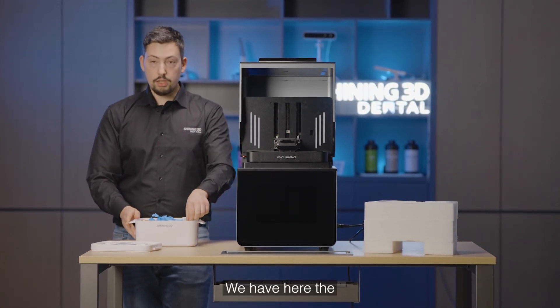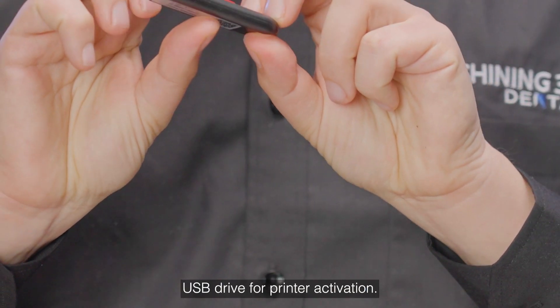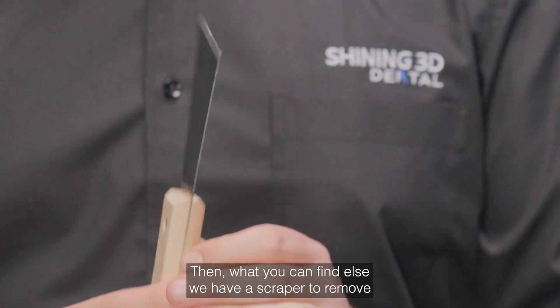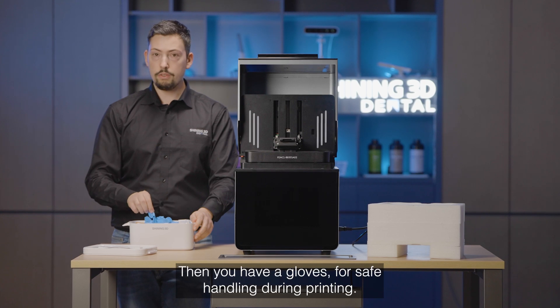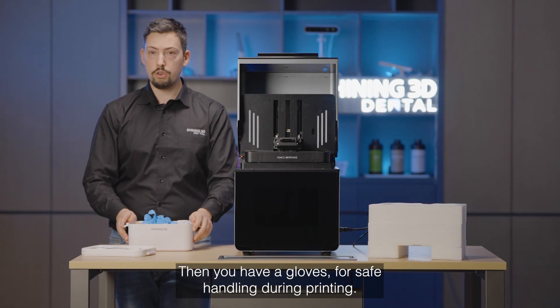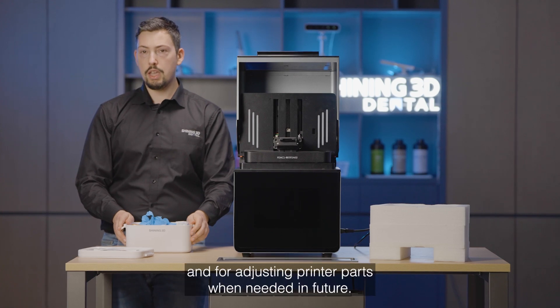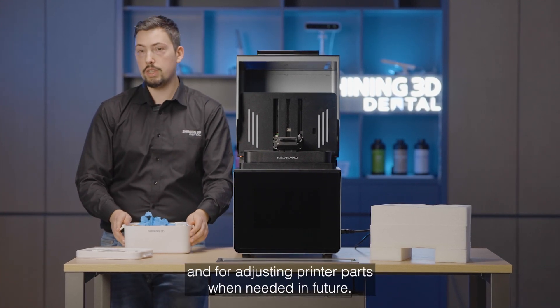We have the USB drive for printer activation. We also have a scraper to remove printed models, gloves for safe handling during printing, and a screwdriver for platform leveling and for adjusting printer parts when needed in the future.